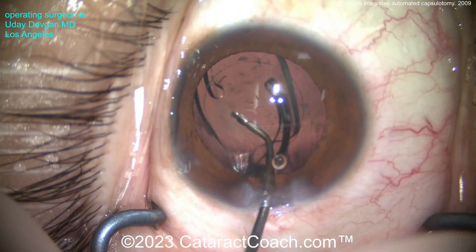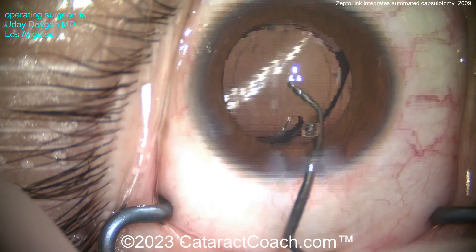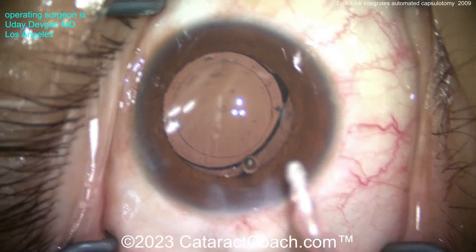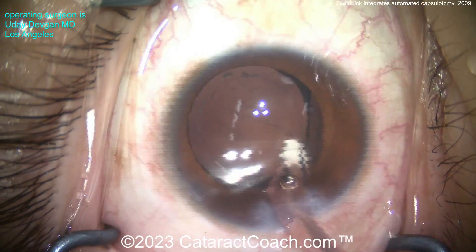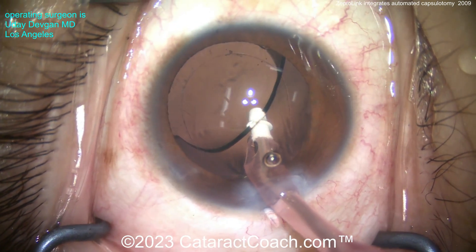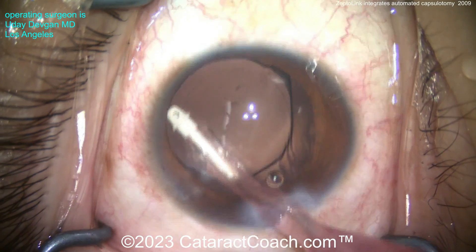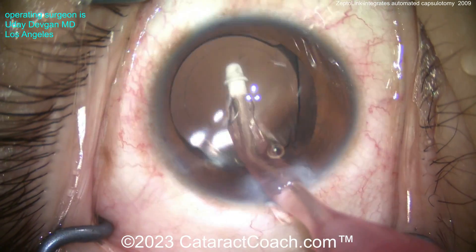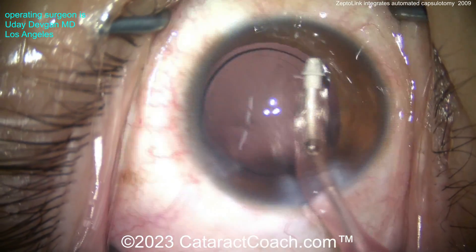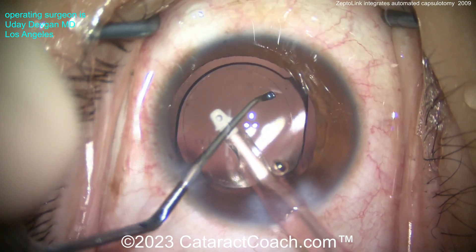Here are the arms opening up and you can see the capsulotomy is strong — these edges are not prone to running out. In this case you saw we flipped the nucleus out of the bag and look at the overlap, exactly what you want. You have the ability to center up that capsule opening wherever you'd like. In this case we put it on the center of the pupil, the visual axis, and the center of the capsular bag. But in some cases you may want to place it a little bit off — for example, if you have a dislocated crystalline lens or traumatic cataract with zonule loss. This allows you to get that capsule opening done very precisely and very easily. Finishing up the case, taking out the viscoelastic — it is really a precise and beautifully done overlap.